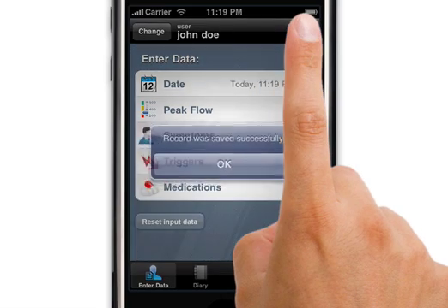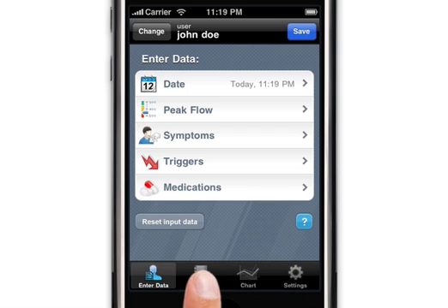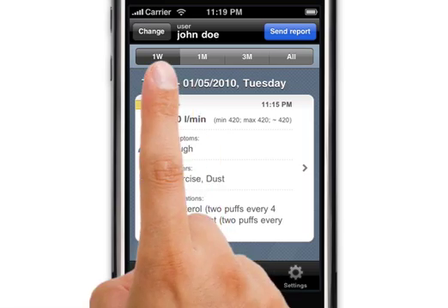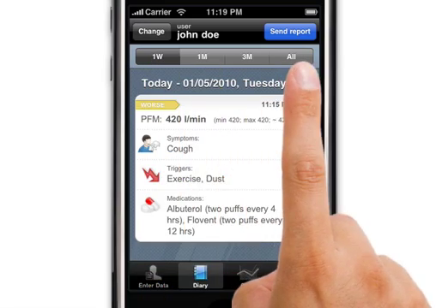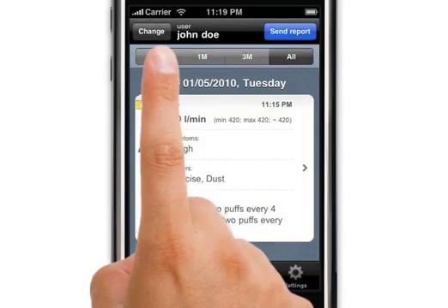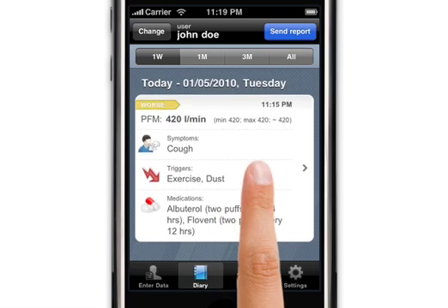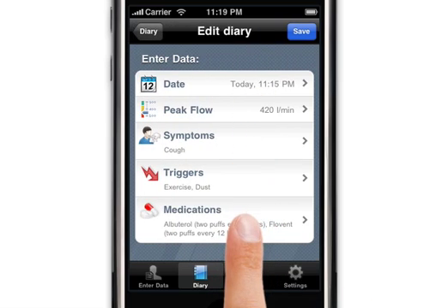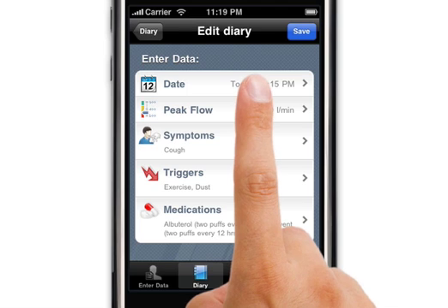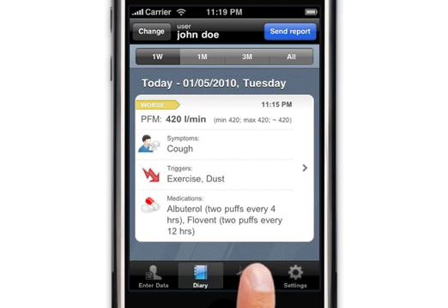This information is now entered into your diary and plotted on the graph. Let's look at the diary. This is how it appears — this is the information you just entered. You can list it by one week, one month, three months, or all the information. You can scroll down to see the rest of them, and by clicking on each entry you can see all the detailed information. You can edit it as necessary.